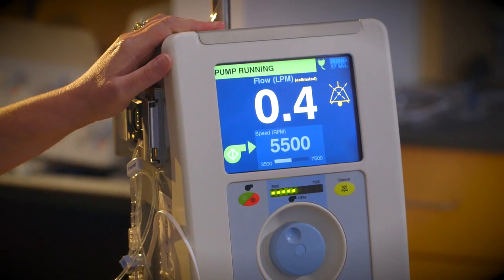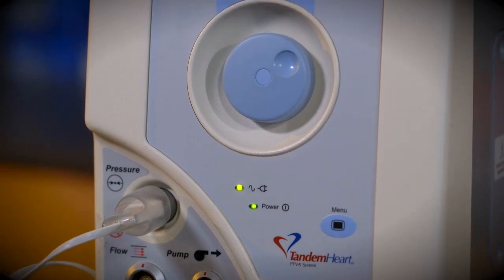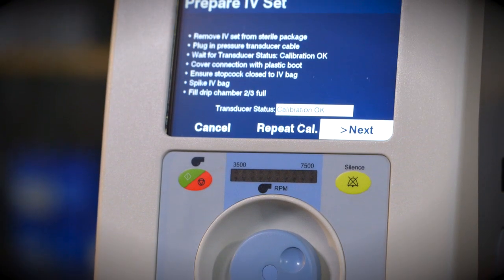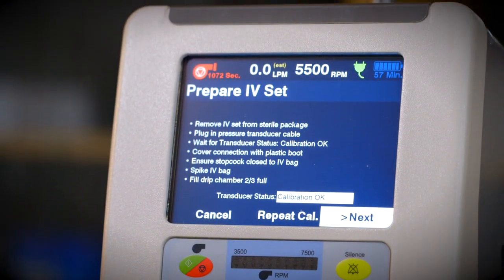The Tandem Heart Controller powers the system, provides diagnostic alarms during operation, and controls flow measurement. The controller incorporates redundant primary and backup control units to ensure reliable, uninterrupted operation.